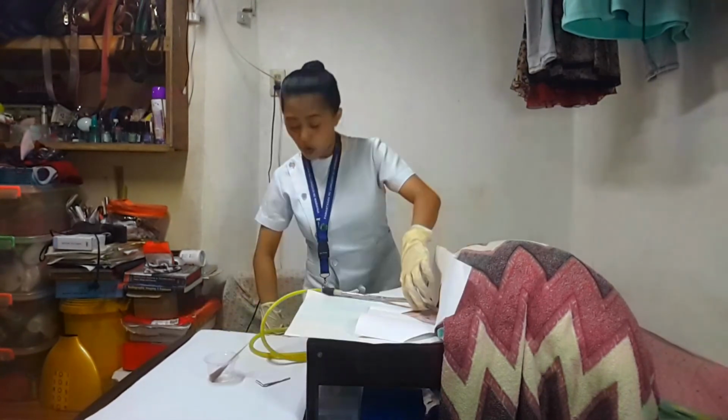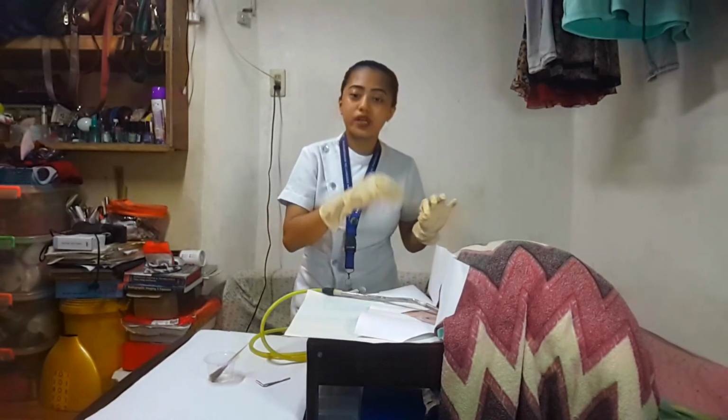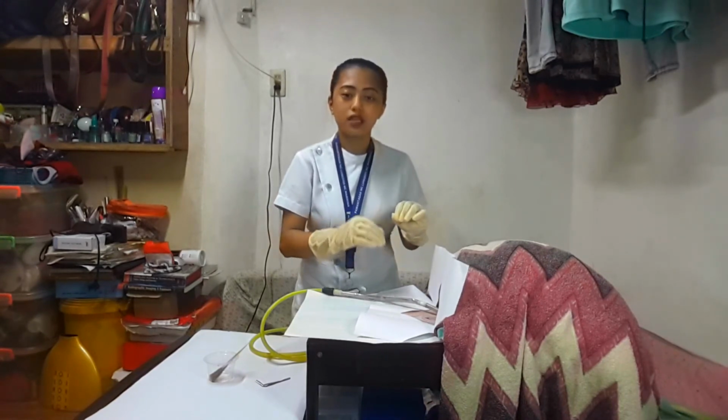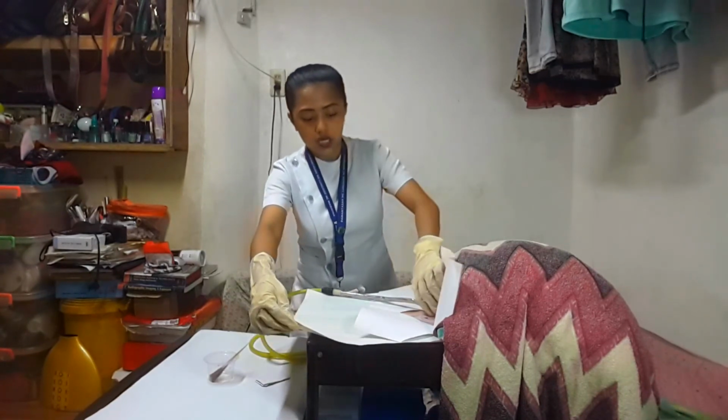Alright. Okay, so after doing that, we need to clean the perineal area with clean wipes or towel, or we need to clean the excess lubricant that we used for the client, and also we need to remove the drape.